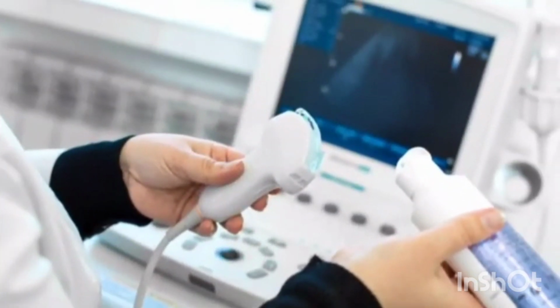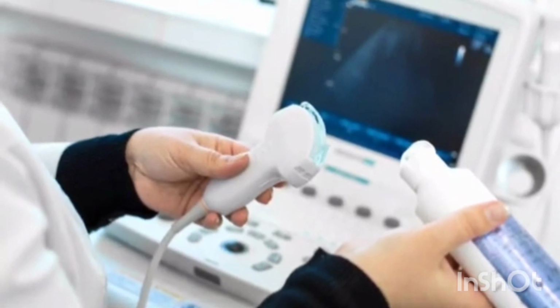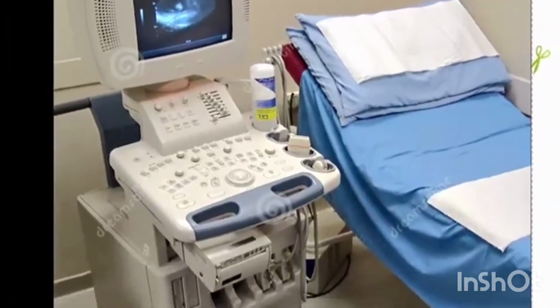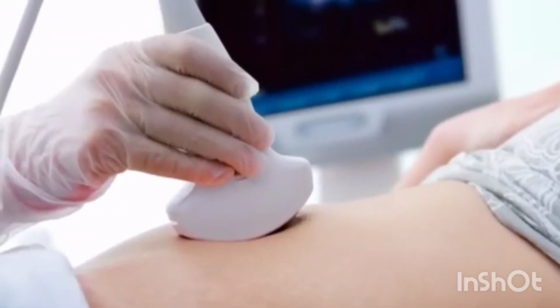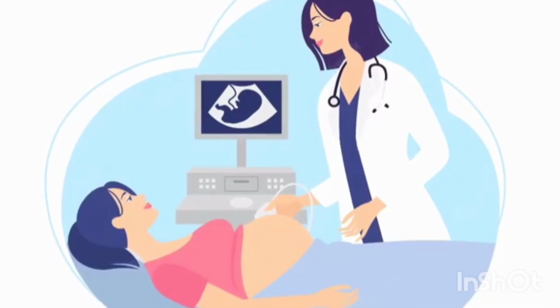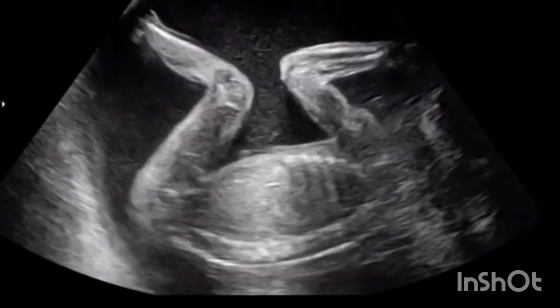First, you need to be familiar with the handling of the transducer. With a convex transducer transabdominally, the patient is made to lie on an examination bed with the transducer sagittally, cursor pointing upwards towards the patient's head. Scan from the pubic region of the mother through the umbilicus, then follow through the lie of the baby.